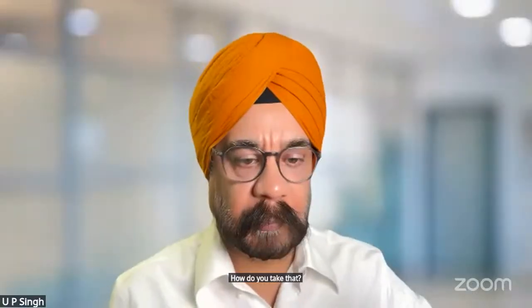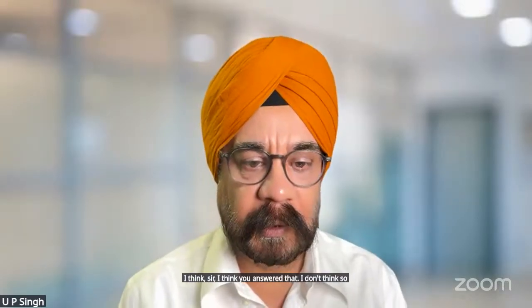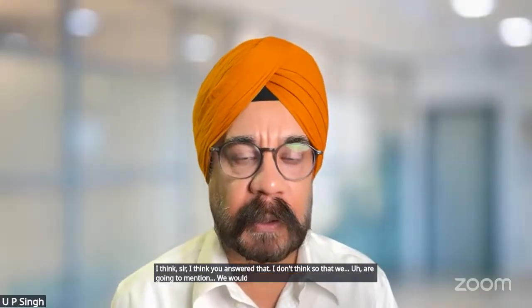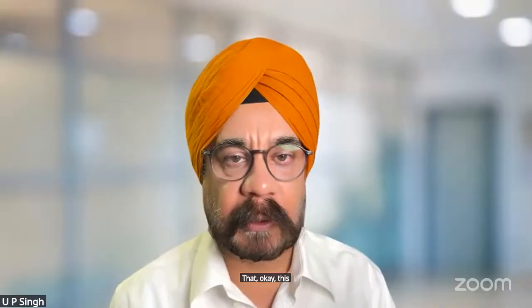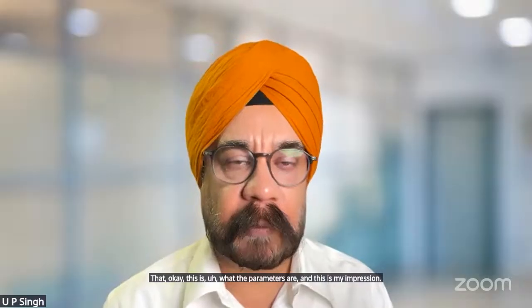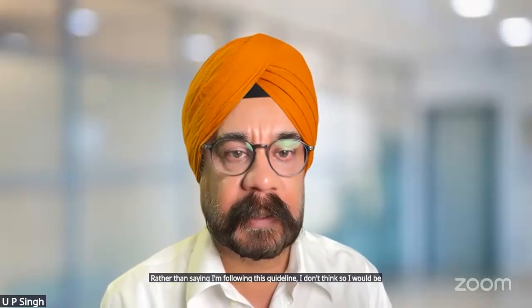I think, sir, you answered that. I don't think we are going to mention it. We would probably mention the parameters and give a suggestion: this is what the parameters are, and this is my impression. Rather than saying I'm following this guideline, I don't think I would be writing that.